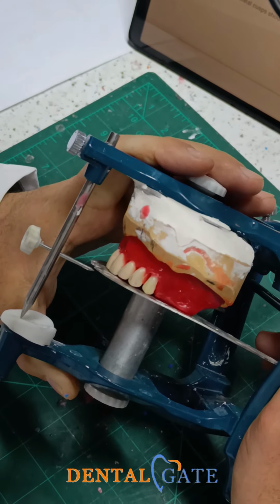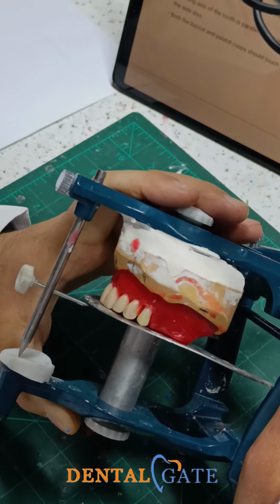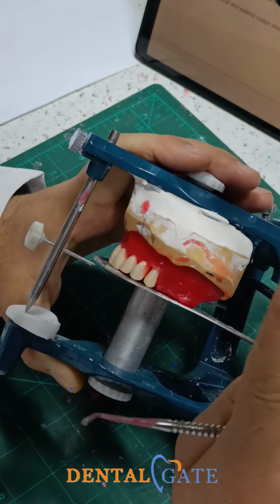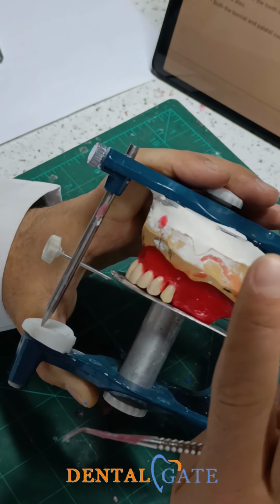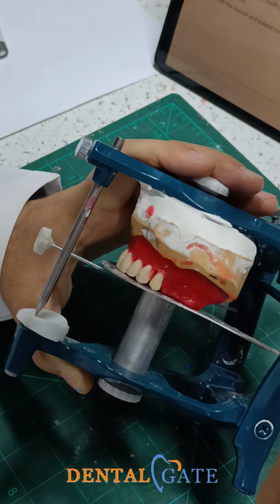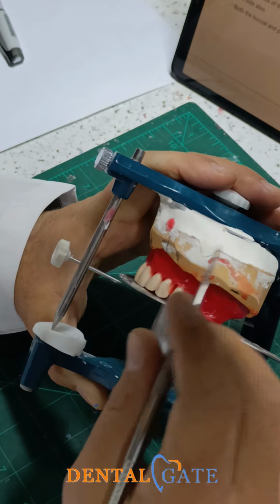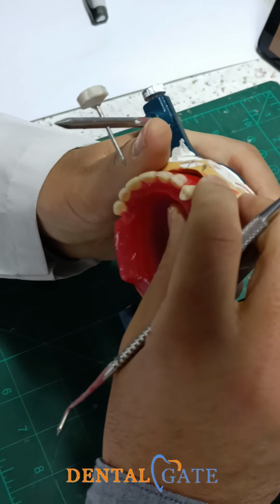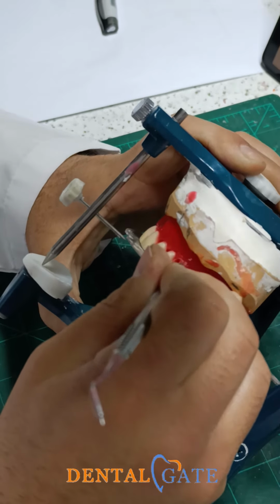So if I put it with the buccal, how can I establish the curve of Wilson? Curve of Wilson, because of the intercuspation of the premolars of the upper and lower. The upper premolar should be included within the two lower premolars. Yes. The two lower premolars have a short lingual cusp. And I want to make contact with the lingual only to make a proper position of the upper cusp included within the lower. So make touch with the lingual one. Okay? This is the main one.